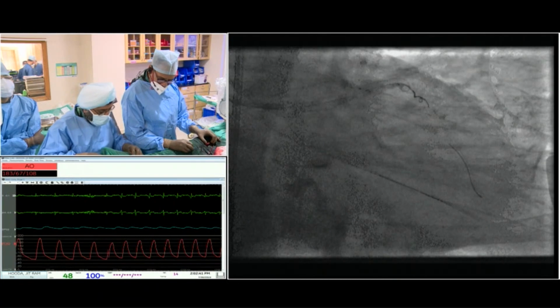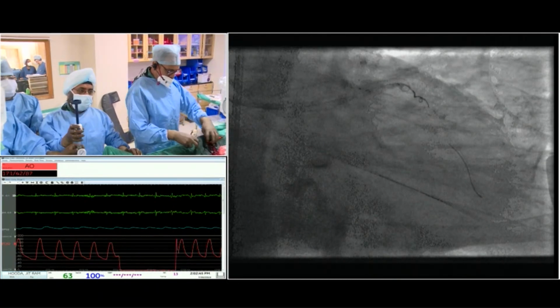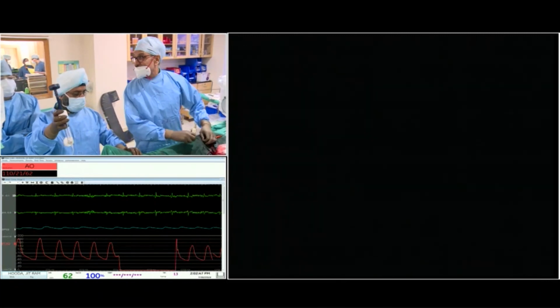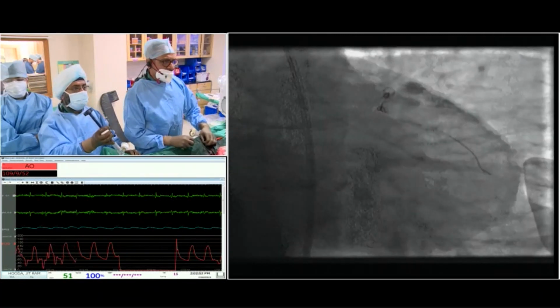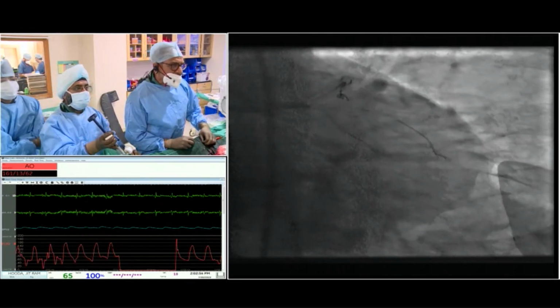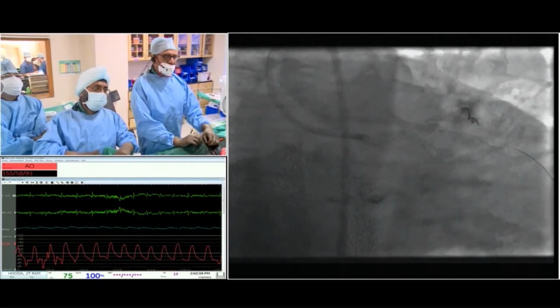It is interesting, the complexity. For bifurcations, the DEFINITION II trial was a 2-stent DK crush versus provisional and showed a benefit, whereas EBC MAIN goes the other way. So I think there's some controversy about it. I think for most people, though, if there's significant length of disease in the side branch, then that's where you're going to opt for a 2-stent strategy.